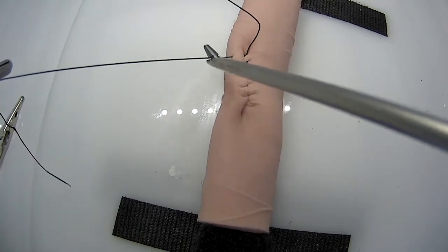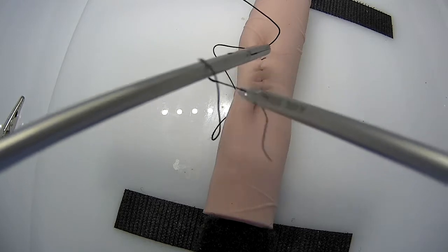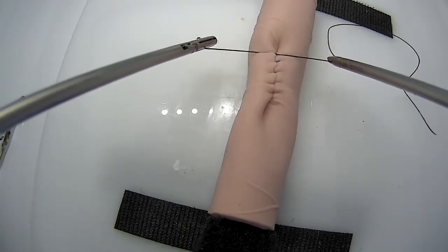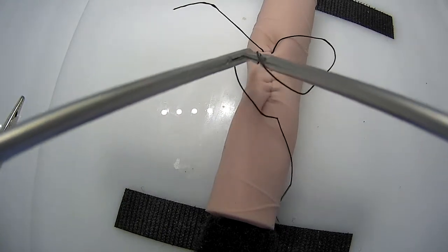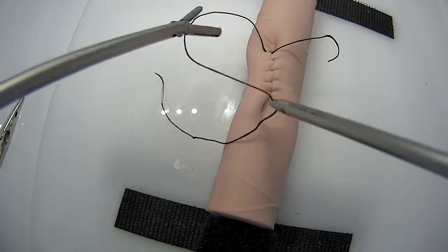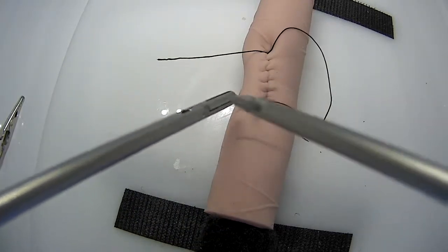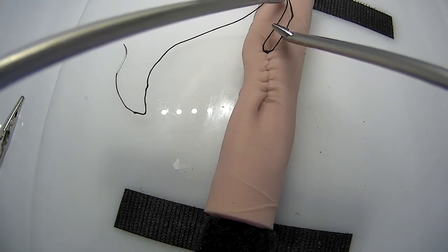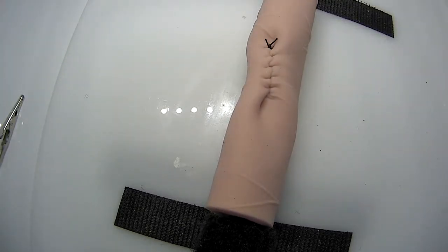I'm going to cinch, and now we're right next to our tail, so it's time to tie. Generally, a surgeon's throw is going to be easiest here, rather than a slip knot. We're going to take care that we don't loosen that first knot. Do our last throw. Cut both tail and body now. And it's finished. You can see a nice imbricated second layer closure.